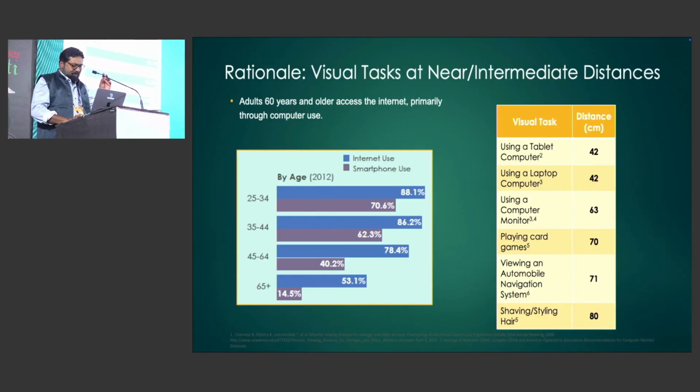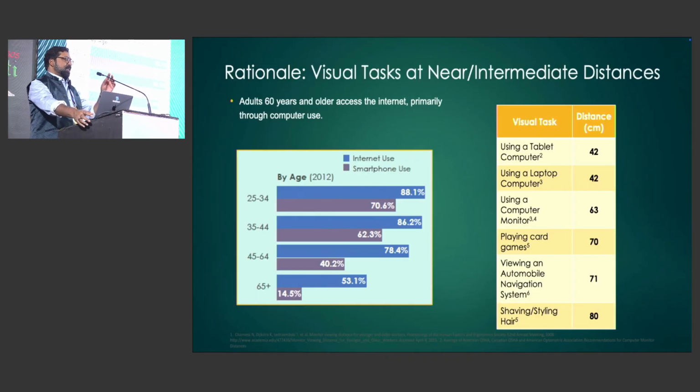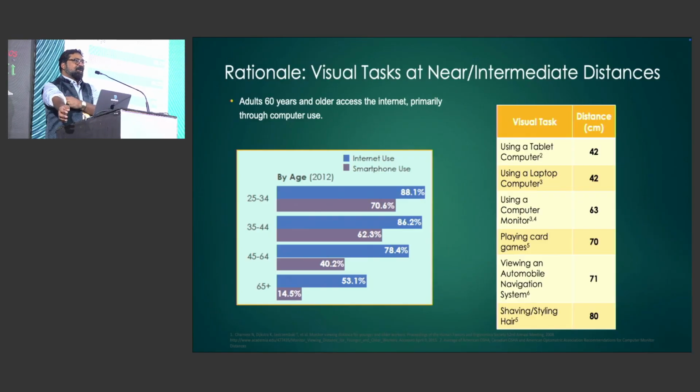Earlier we had a situation where you could offer the patient a couple of lenses, Indian, foreign, foldable, etc. But we never used to really worry about what the span of vision is, what the patient really needs.